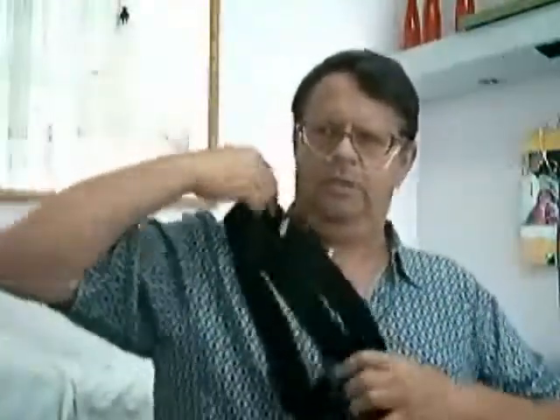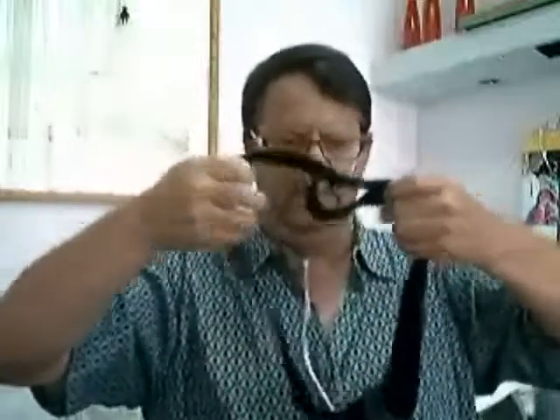Then place it over your chest. At night, it stays on your chest.